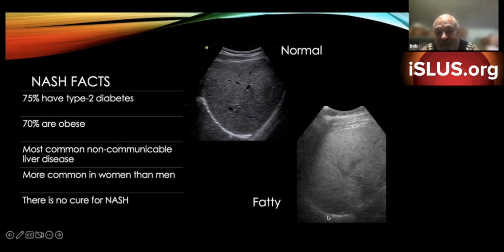And actually, you can see this diaphragm, we can barely see blood vessels. They're full of echoes if we can see them. So a fatty liver really changes the architecture of the liver, which in turn gives us the properties we want to try to determine how severe this fatty liver is.